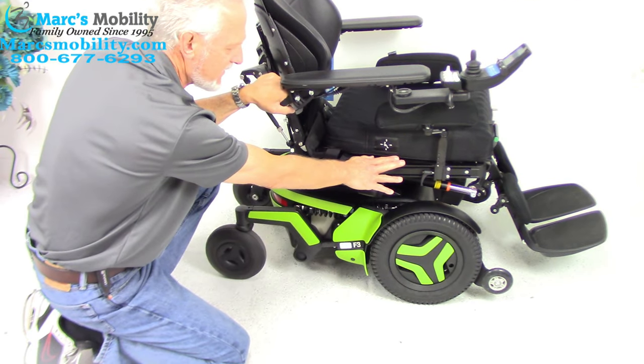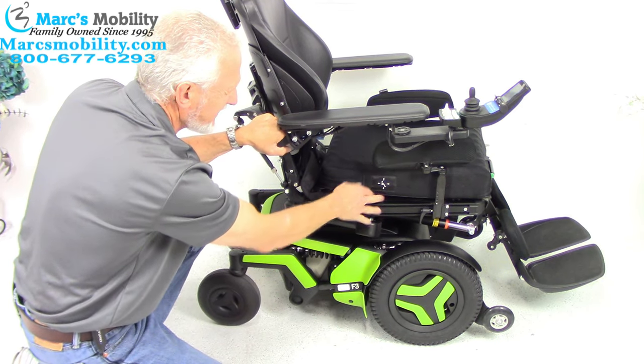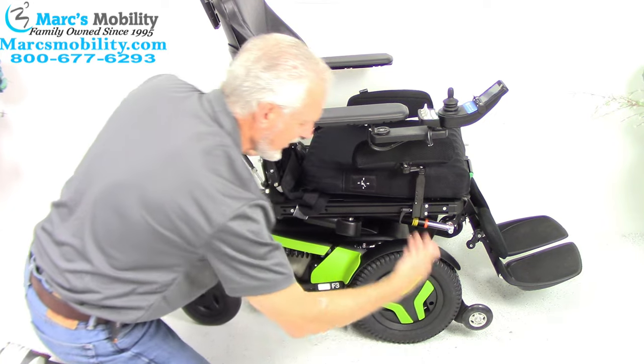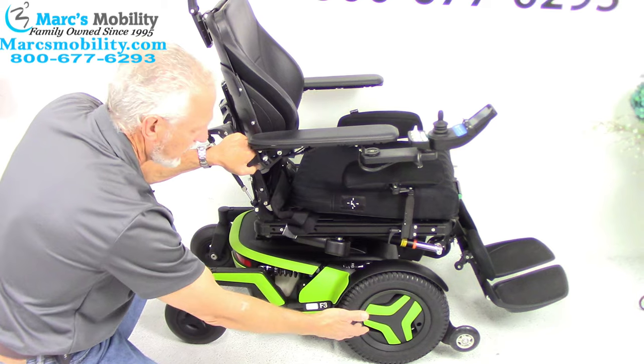This chair right here weighs 350 pounds. So if you have a 300-pound person in a 300-pound chair, that's 600 pounds — all the weight is transferred here, so it's good for tracking. The wheels will not spin outside, so these are good in the grass because they're front wheel drive. They're also good in the house.